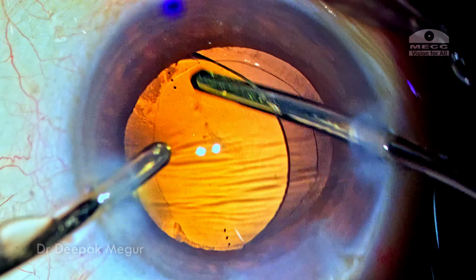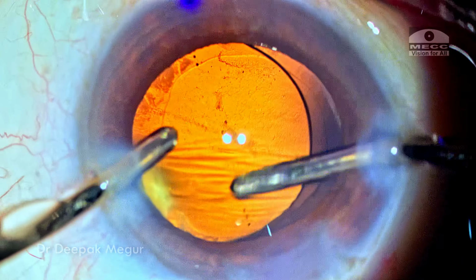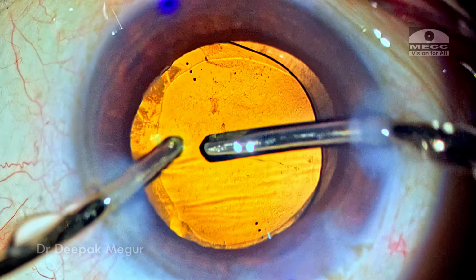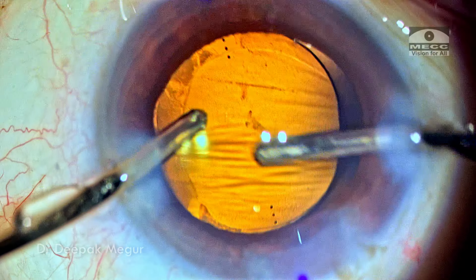And this is all possible, just a matter of time. The only price we need to pay is a little bit more time, and because it ensures greater safety in such eyes, it's worthwhile spending those extra few minutes. Finally, every bit of OVD seems to be out.